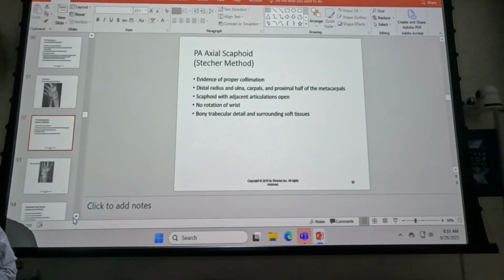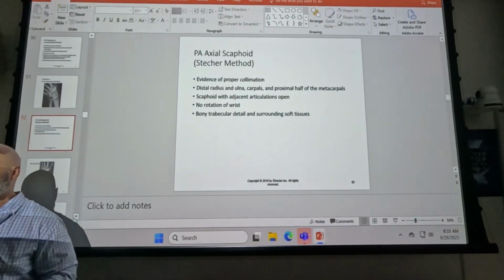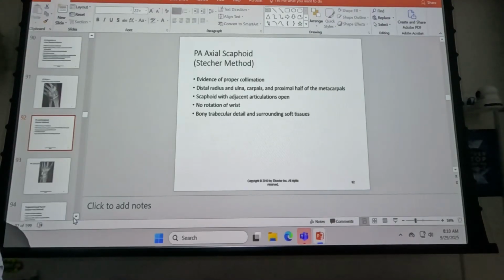Every hospital I've ever worked in combined those two things. Okay, so again, clinical correlation. I've never worked in a hospital that didn't do both of them at the same time. Maybe a doctor's clinic might do one individually. So don't be surprised if you see the tech doing that, both using the ulnar deviation plus the 20-degree cephalic angulation. That's probably what you're going to see clinically. Okay, so that's generally physician's choice, preference, hospital preference, protocol. You don't see it in the textbook, but you'll see it in clinicals most likely pretty regularly.